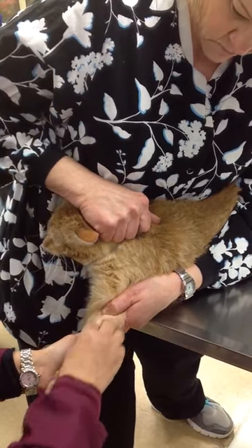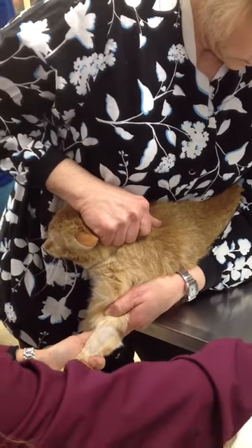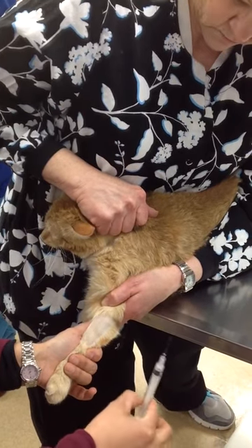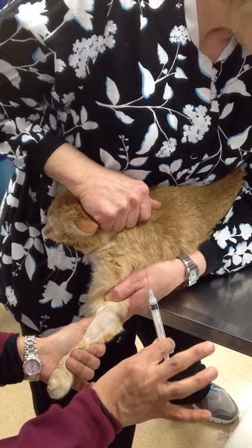Just swipe with alcohol and you can see that cephalic vessel standing up really nice. Uncap my needle, make sure the seal is broken. Bevel up. You can see where my fingers are on the syringe, way down by the wings.